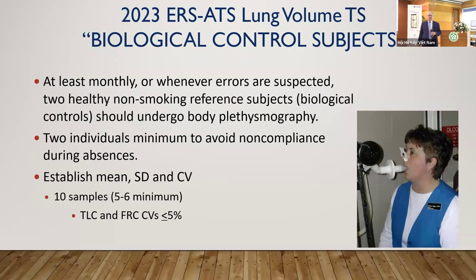The other item that you can use to verify the accuracy of your device is taking a normal subject, a human, and having them test themselves to make sure that they end up getting the same answer every time they test. Và tiếp theo thì mình có cái định chuẩn sinh học dùng người, mà mình đảm bảo là mỗi một cái lần mình đo như vậy nó trả lời đúng cái câu hỏi, đúng cái giá trị của bệnh nhân. And so the repeatability or reproducibility should be within 5% for your TLC or FRC measurement in a normal individual every time they test.